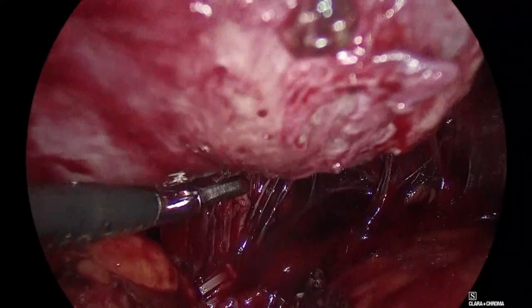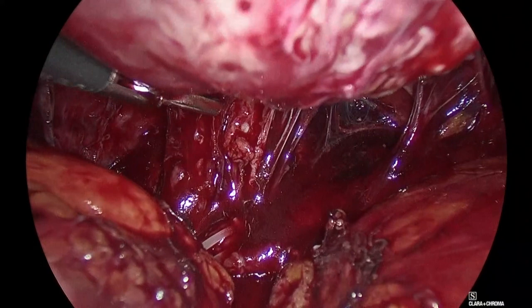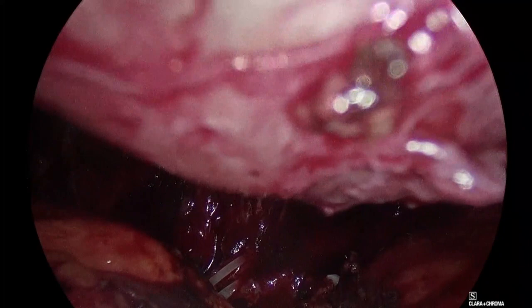There you go. This move. Let me go in also with my grasper. I grasp the prostate, pull it out. This is the move that detaches the apex. Good, go back. Pull this further down, Panayuti, the fat, so we can go in.